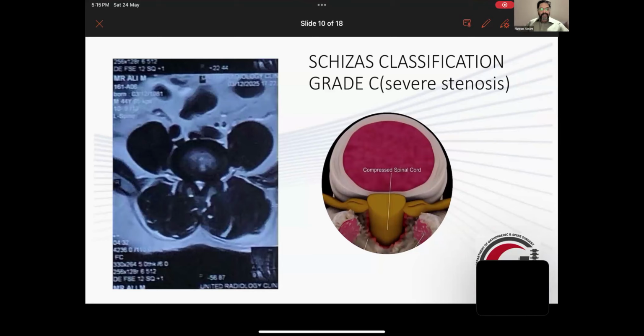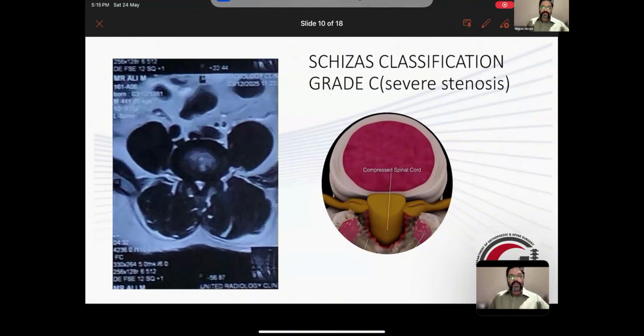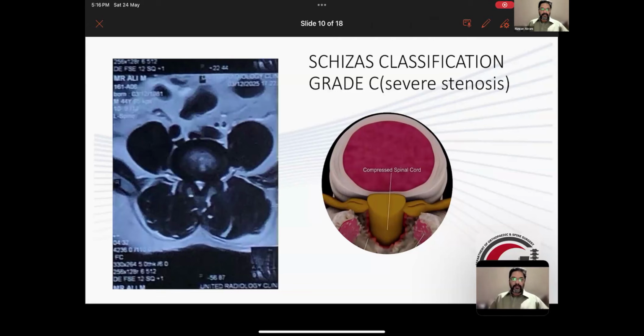Actually, I was thinking about it as Enrique was asking, what about the L5-S1? First of all, the principle remains the same: the one level which was symptomatic. So we chose to operate, like in open surgeries, on the symptomatic disc. At the time of surgery we chose to go in for the symptomatic level.